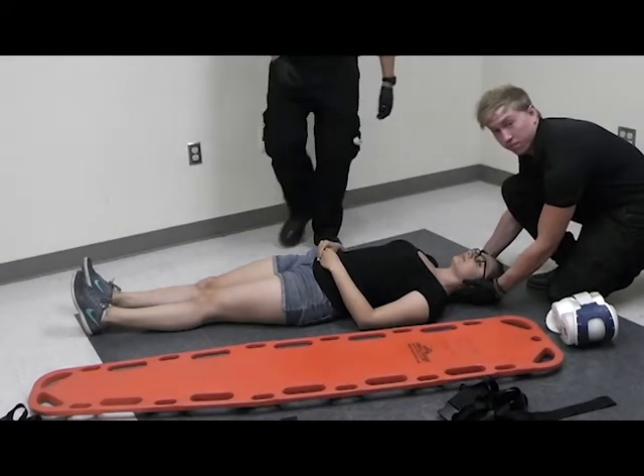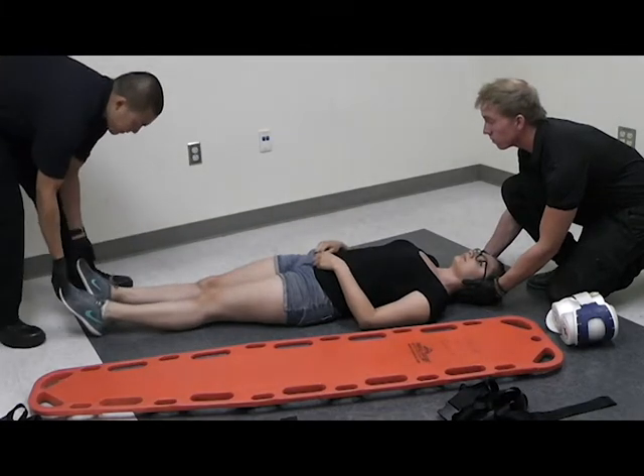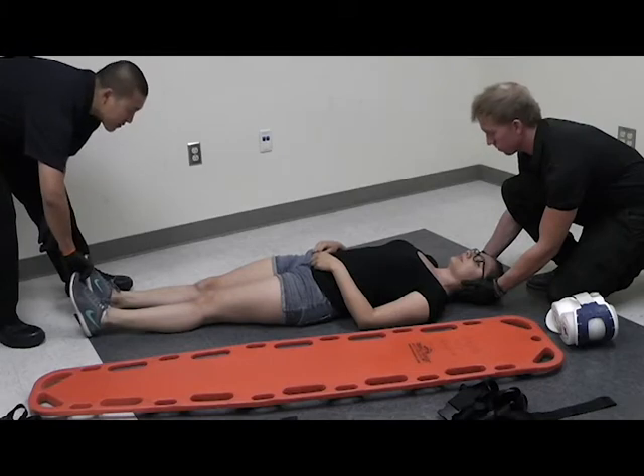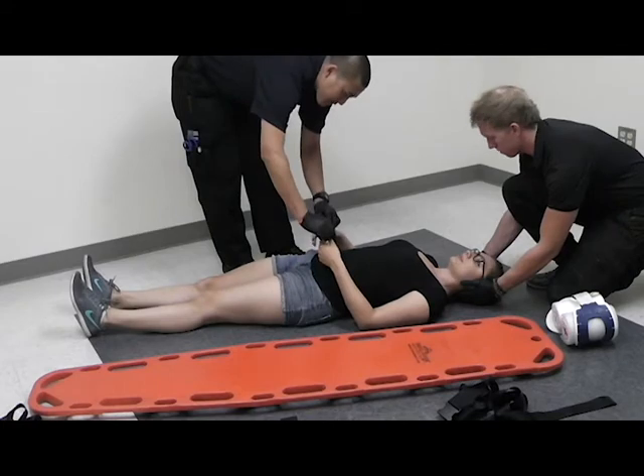Next, I'm going to assess CMS — circulation, motor, and sensation. Keep wiggling your fingers. Press down, pull up. Which toe am I pressing on? Which finger am I grabbing? Right thumb. Alright.